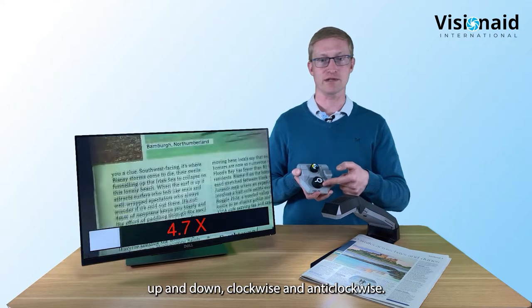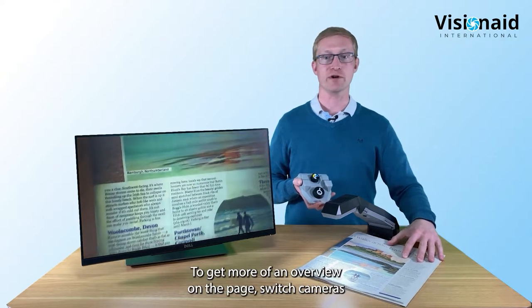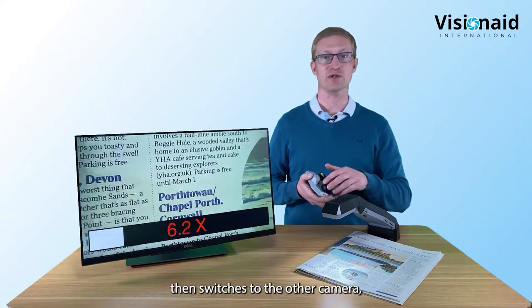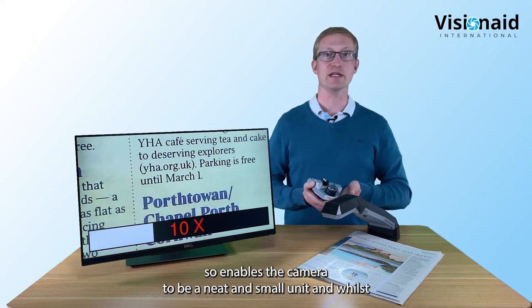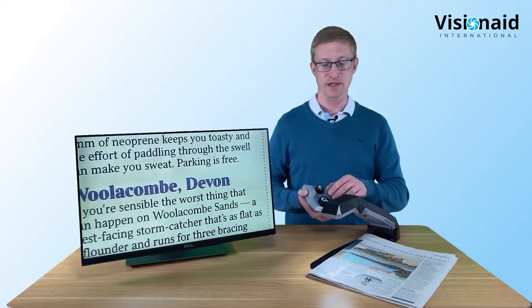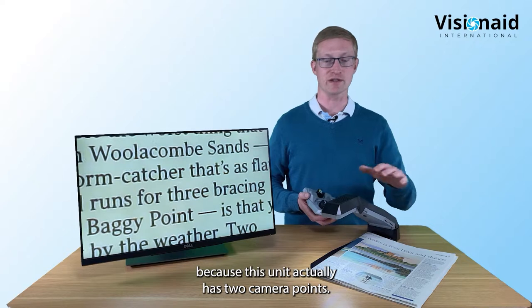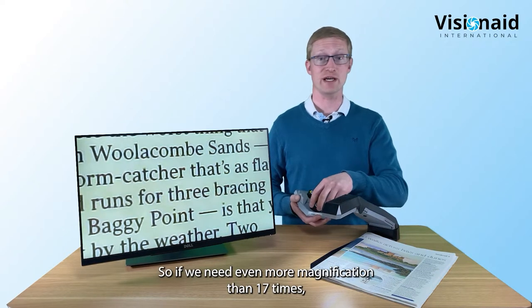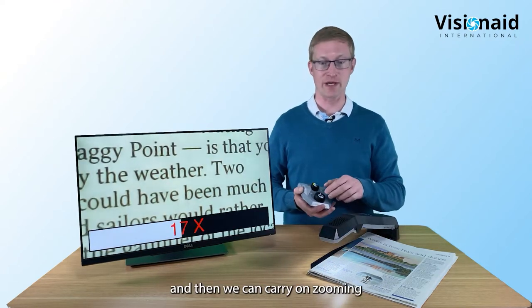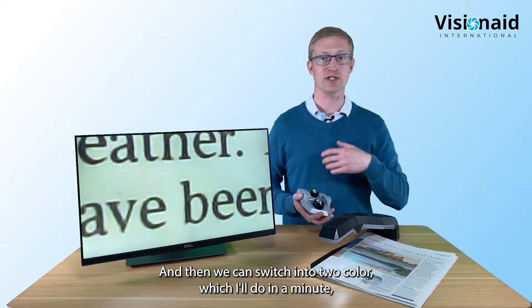The Helix has a unique twin camera system. When you zoom out for an overview it switches cameras, and around five times it switches to the other camera. This enables the camera to be neat and small whilst maintaining the best image quality. If you zoom all the way up, it tells you to lower the camera head - the unit has two camera heights. Lowering it allows you to continue zooming up to 50 times in color.